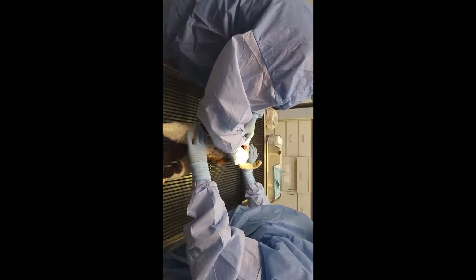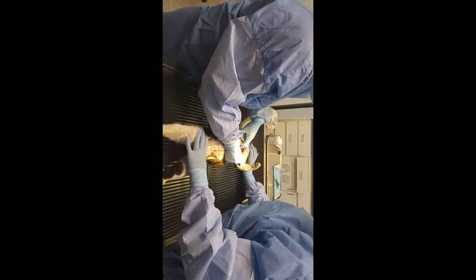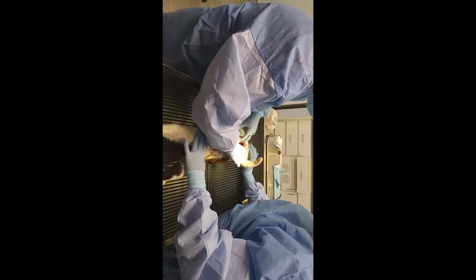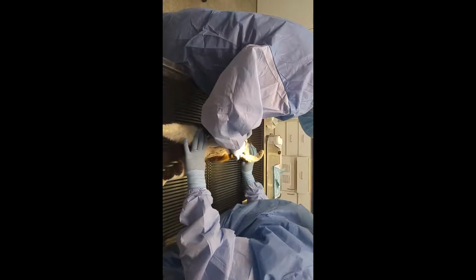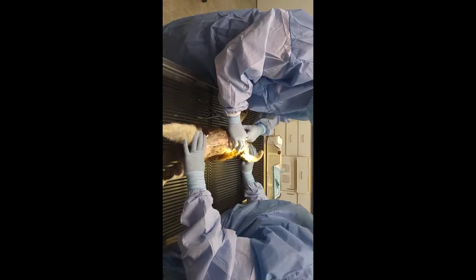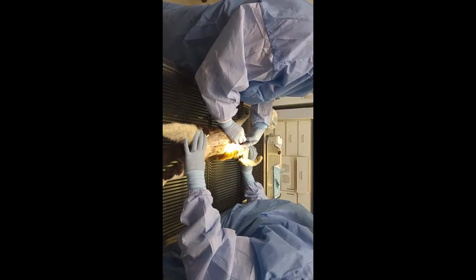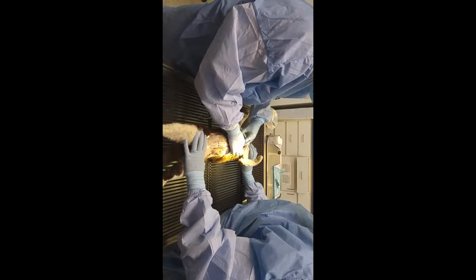The first thing to do is just to take a peek in there, and we can actually see the heart. The lungs, you want to look at them, visually inspect them, check their color. They actually appear normal for a postmortem, very smooth. The heart is a normal size and shape.